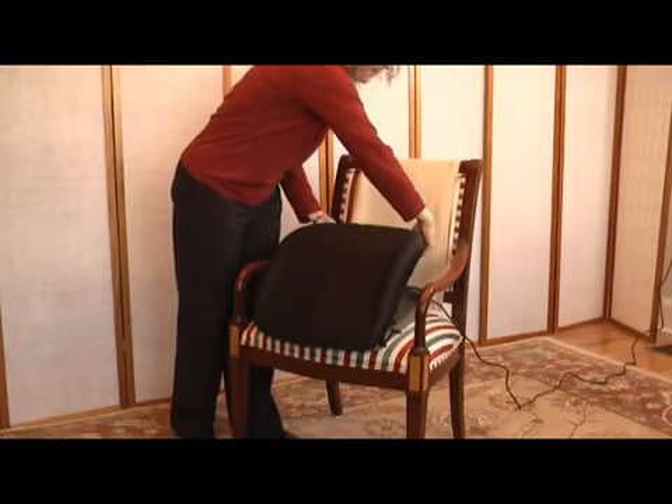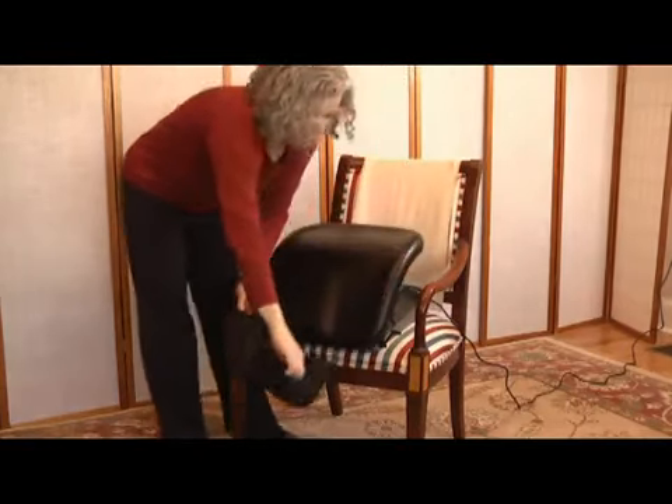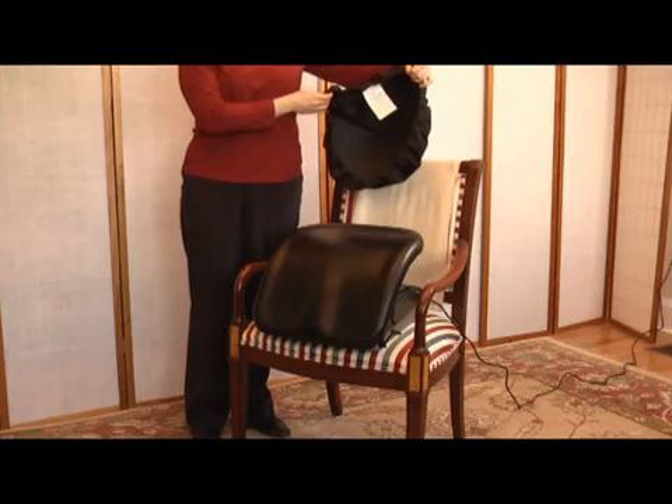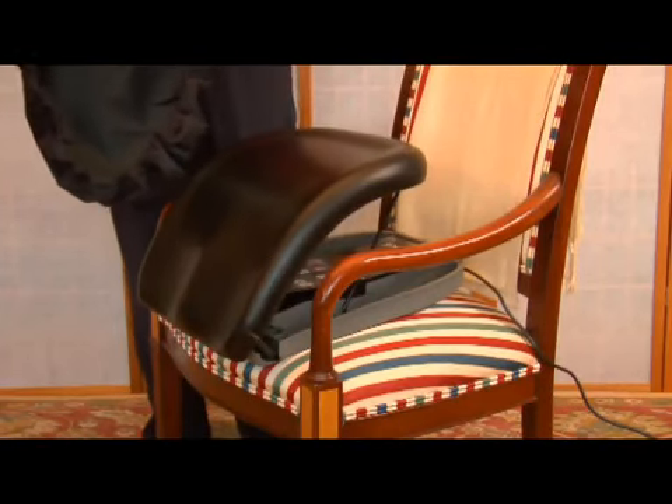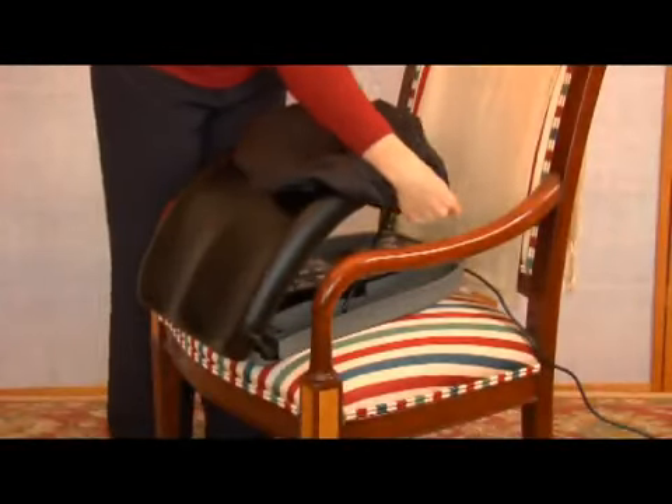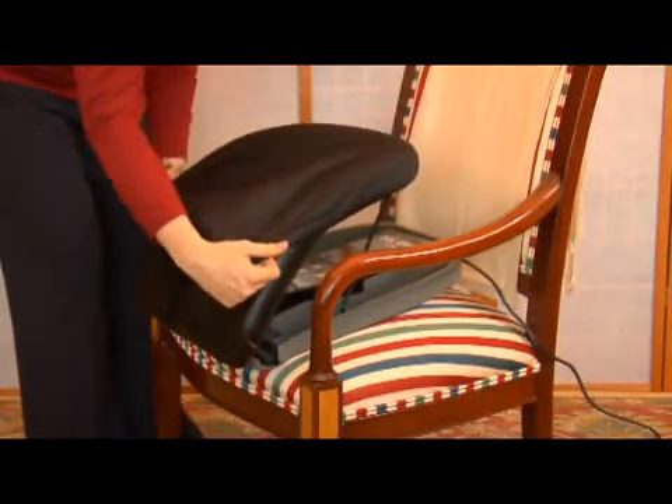When you want to remove the cover and clean your PowerSeat, simply grasp the end of the cover with the white tag sewn in. Lift and it slips off easily. Wipe the surface of the cushion with a damp cloth, then machine wash the cover and let it air dry. To put the cover back on, place the end with the white tag at the top of the cushion opposite the carry handle, and work the cover evenly down over the cushion.